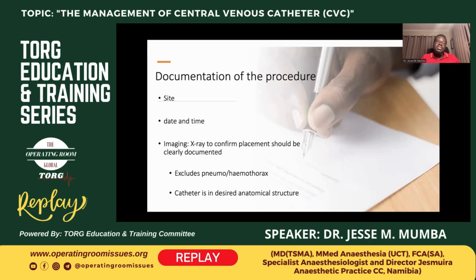So if it's a standard CVP, for example, most of them are 5 to 7 days. By the 7th day, if you're still going to need a central line, you need to remove that one and insert it in another place. If you have one that is long-term, we have the ones for 21 days and above, then you need to indicate the date when that line was put in, so that the person who's going to look after it can quickly and easily see and be able to verify whether the line has overstayed or it's within the recommended time.